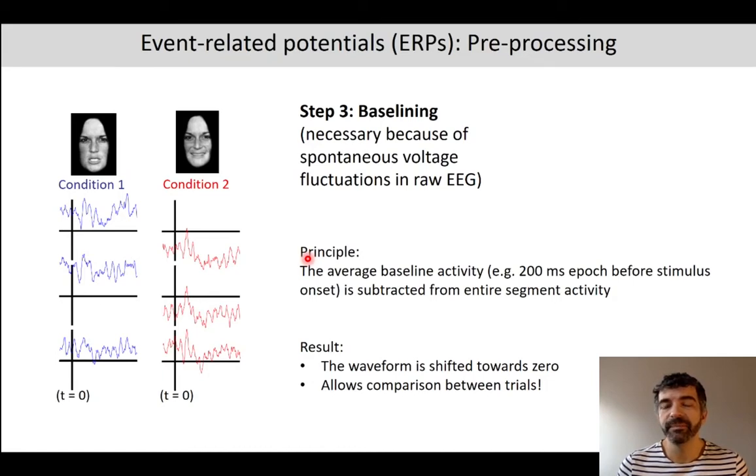That's, so to say, the standard EEG level at which we are expecting the EEG signal to be. And then anything after these 200 milliseconds due to the stimulus onset would be the actual deflection in the EEG signal due to the onset.